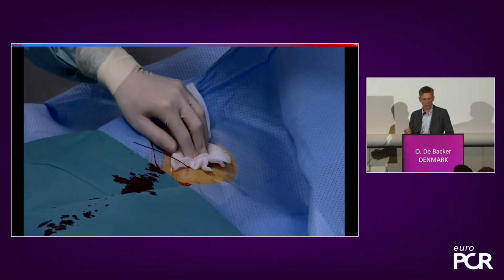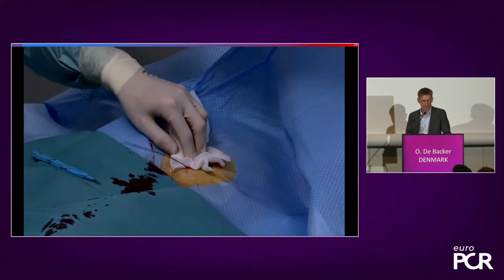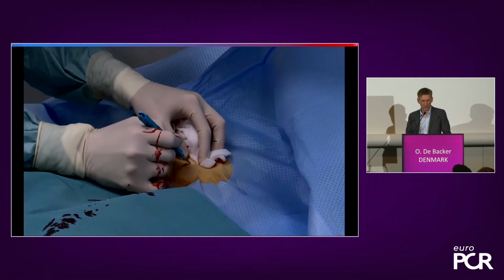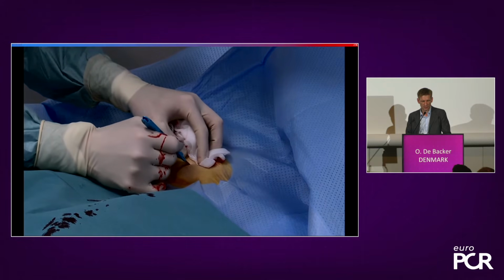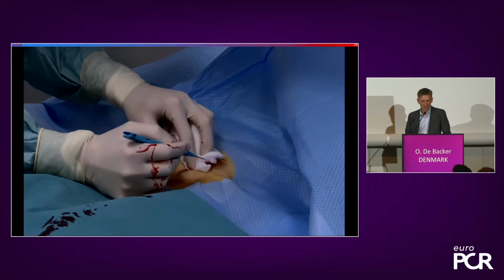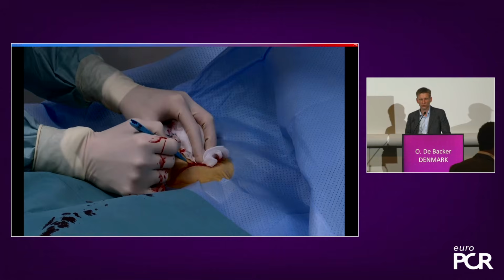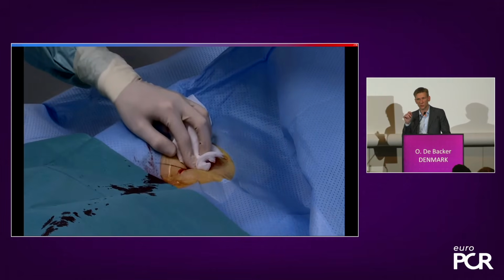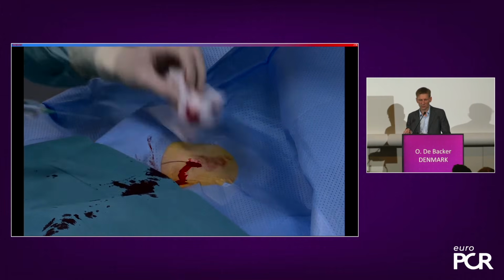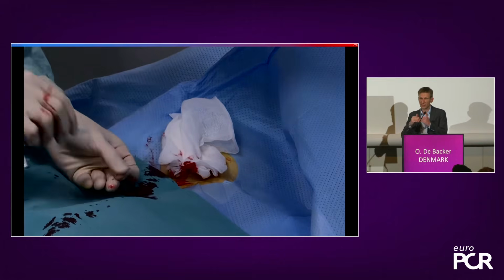Of course, the first thing I do is make a skin incision of roughly 6-8 millimeters. And this is to show you then the deployment of the Prostyles. So we make the skin incision first. After this, we will go in with a 6 French sheath. After your puncture, you always have to go in with a 6 French sheath. If you don't, and go immediately in with your Prostyle, you will not be able to enter the artery, or you may kink your wire.